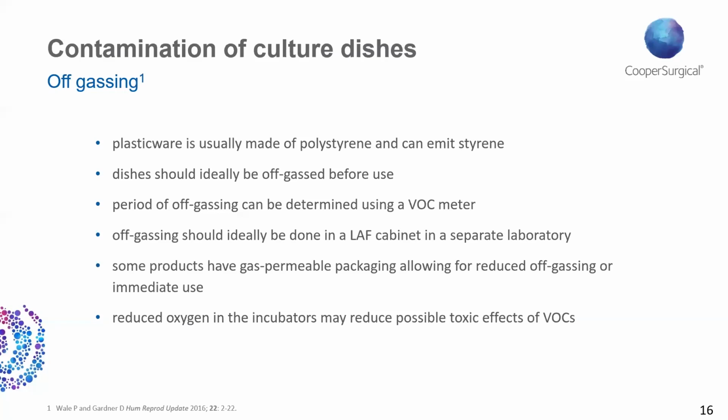They're important to control in the first instance. And again, when we're talking about oil, it not only protects you from evaporation, but it also protects you from the accumulation of VOCs. So again, we need to be cautious in whether we think we should replace oil in the dishes or not. And we'll talk about that in a little while.